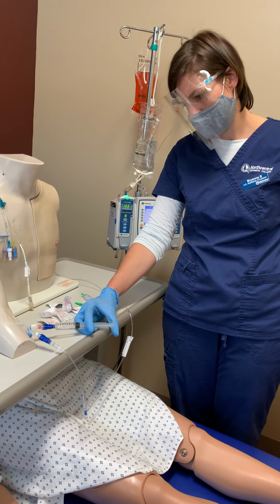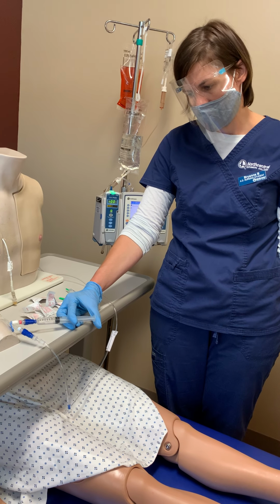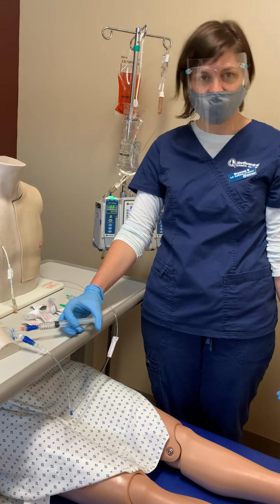Okay, so we'll say 5 minutes have passed. Okay, we're here, 5 minutes have passed, and I can just finish out this guy. Since it's a PICC, I can pulse already, and I'm pulsing just to make sure that we don't end up with any sediment or anything in that PICC.